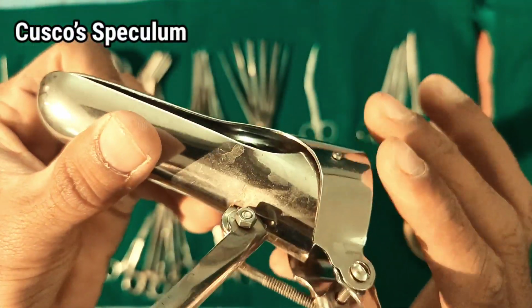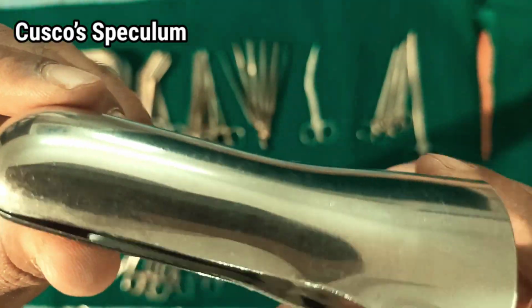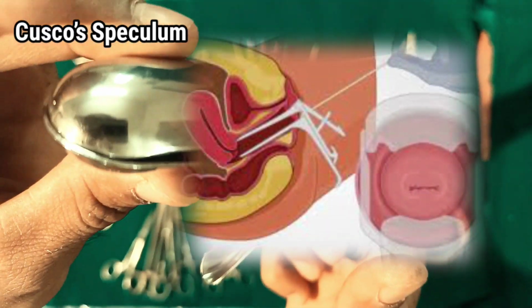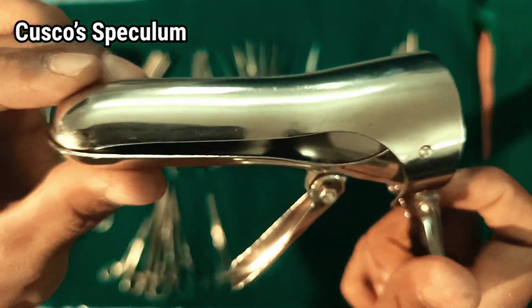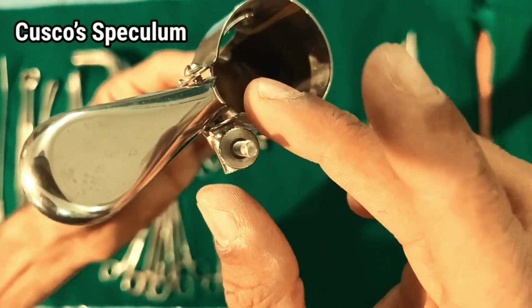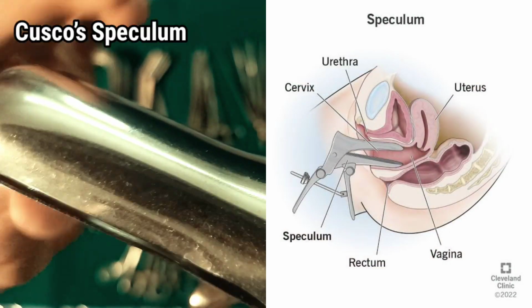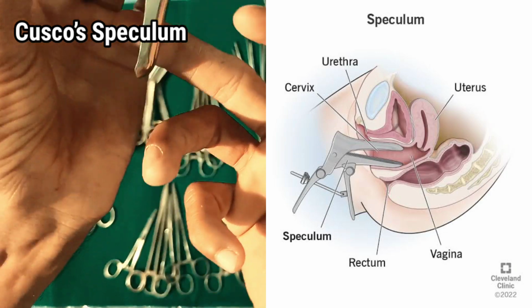In gynecology, Cusco's self-retaining bivalve speculum is a kind of speculum used for vaginal and cervical examinations. It has a jaw that opens up like a duckbill. It comes in three models: side screw, center screw, and special narrow virgin size. Cusco speculum is used for introducing an intrauterine contraceptive device, taking a pap smear, cauterization of vaginal erosion, and colposcopic examination.